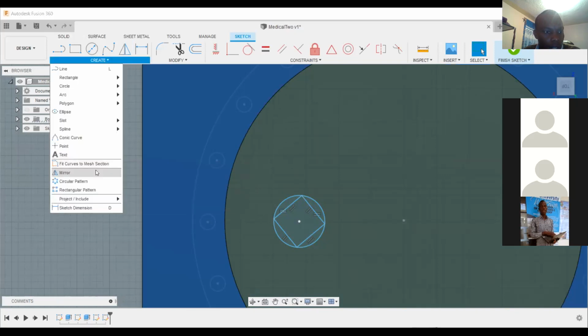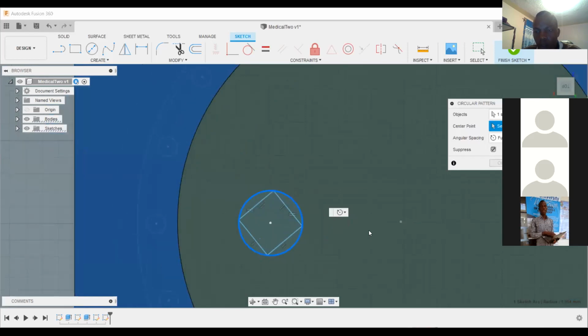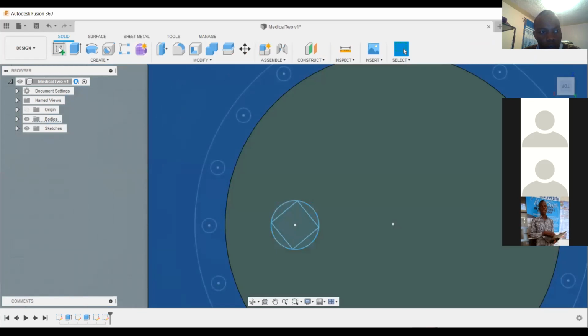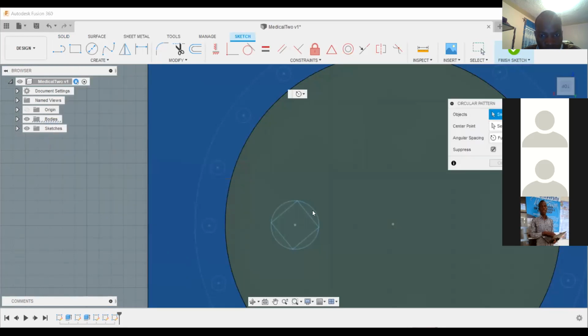So sorry. So you click create circular pattern. Then you click create, select center point. You should click inside here. Let's see. Select.